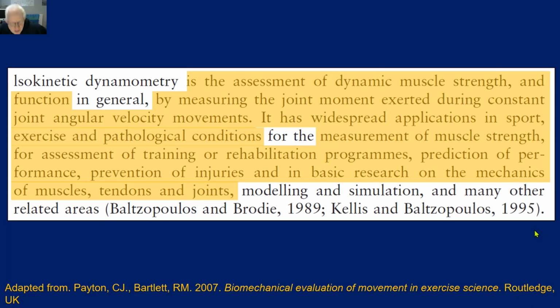So let's just reflect a little bit on what Carl Payton is writing here in this paragraph. So if we start in terms of the basic principles of isokinetic dynamometry, it's what we'd expect. It's an assessment of strength, but it's about what's called joint moments. We'll explain what moments are as we go through, but fundamentally we're assessing angular displacement, angular velocities, a force produced across the range of motion. So fundamentally we're assessing, he's referred to joint moments, we can refer to this in the principles of what we're dealing with here as torque, rather than actually assessing force.